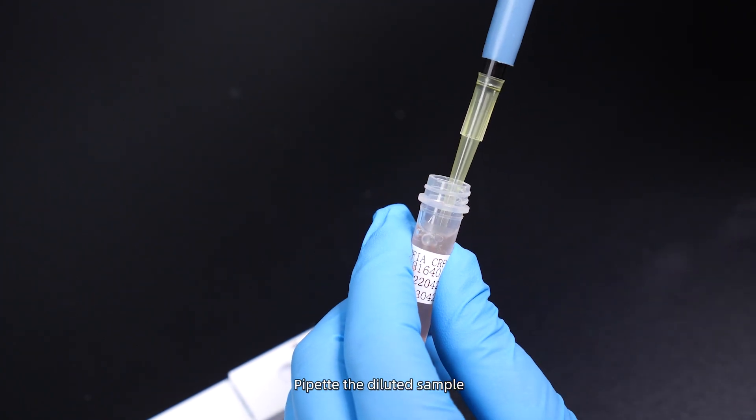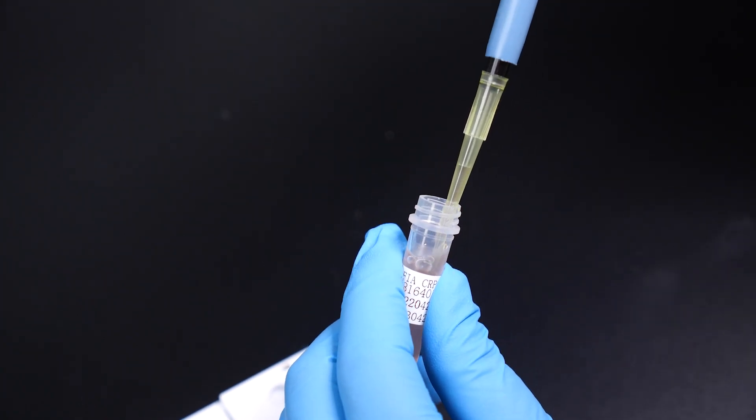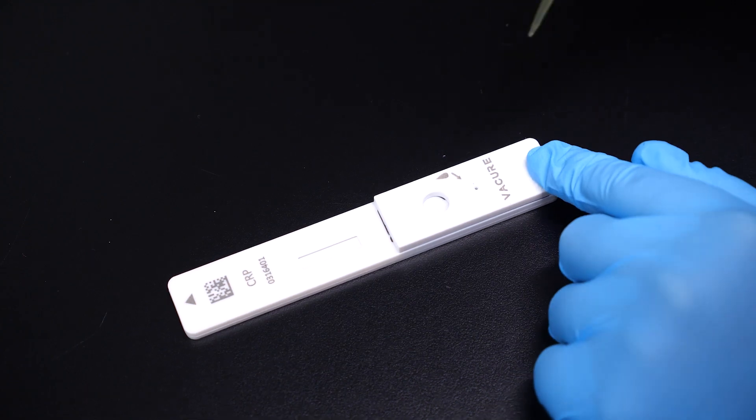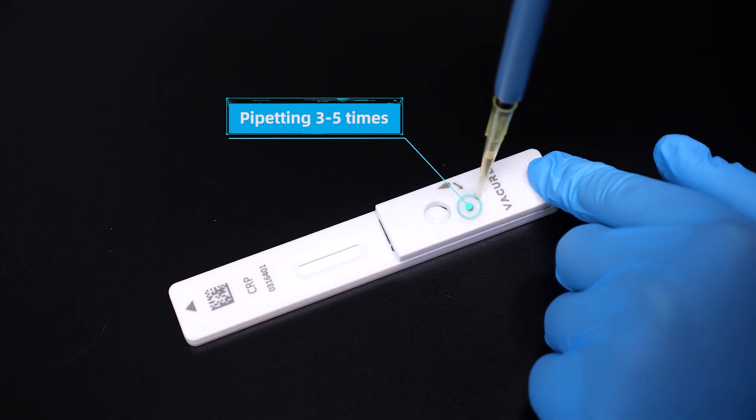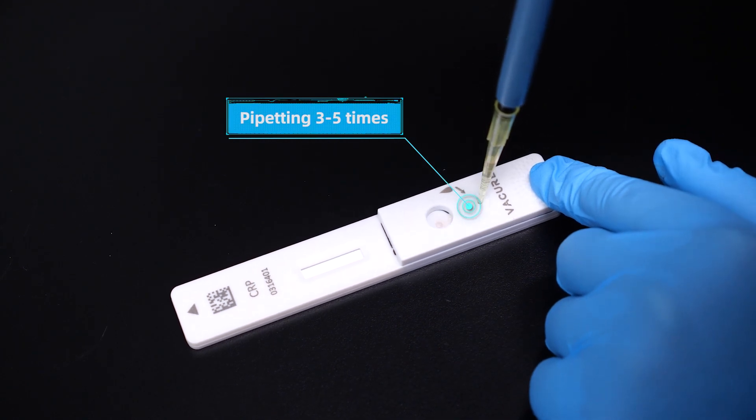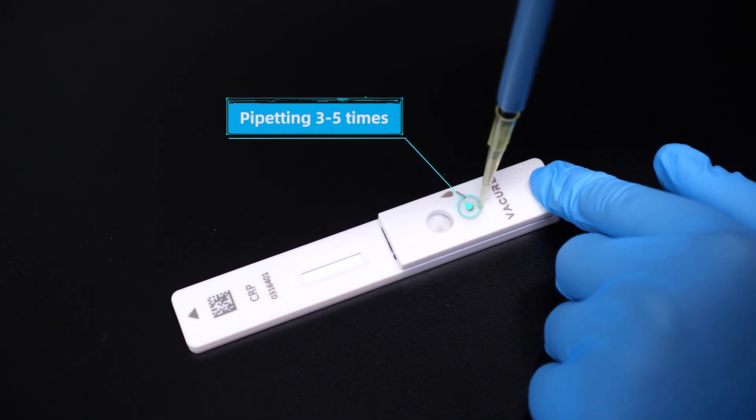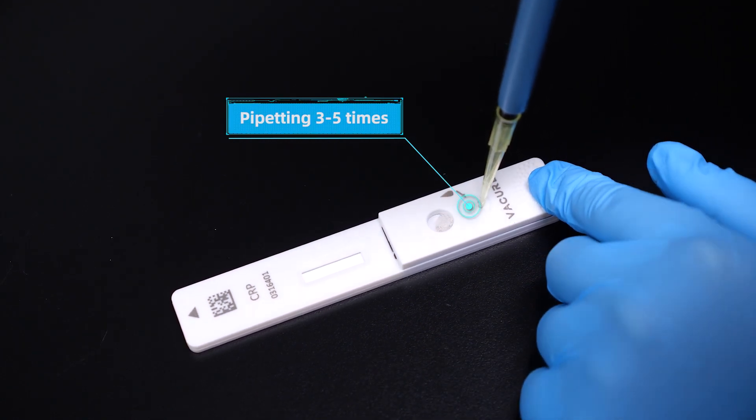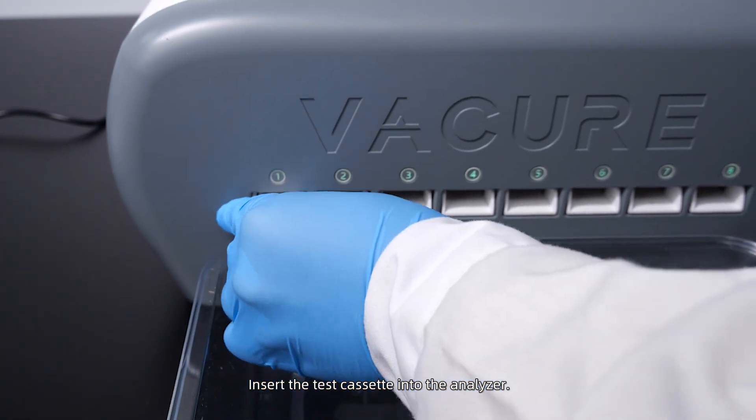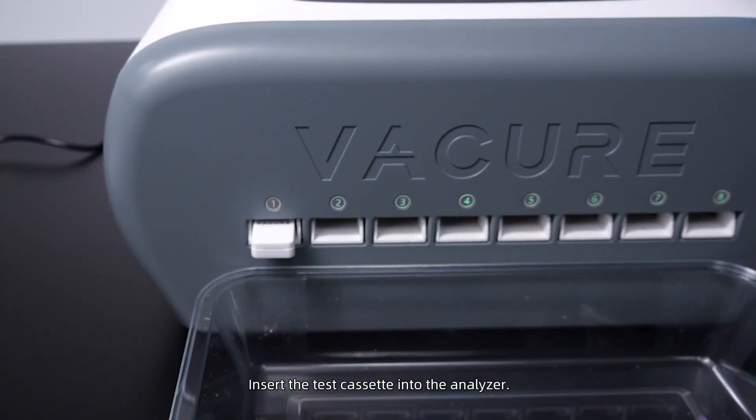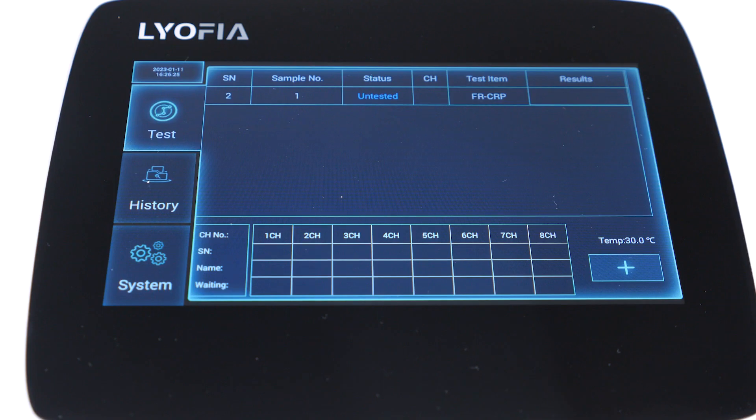Pipet and add the diluted sample to the sample hole. Insert the test cassette into the analyzer. The test has started.